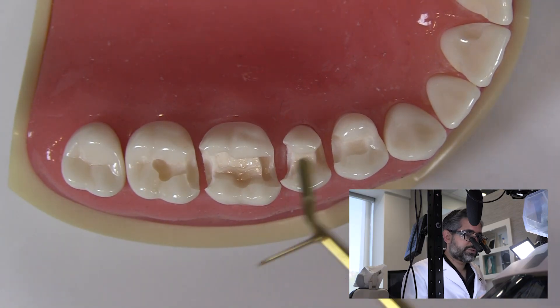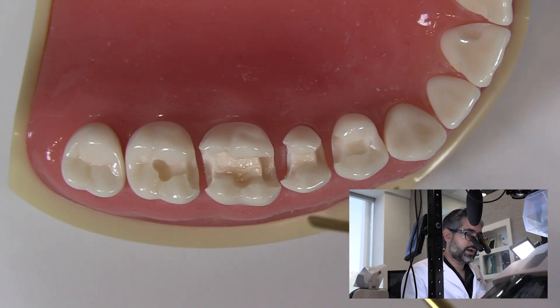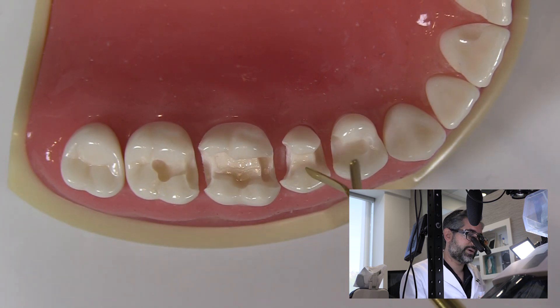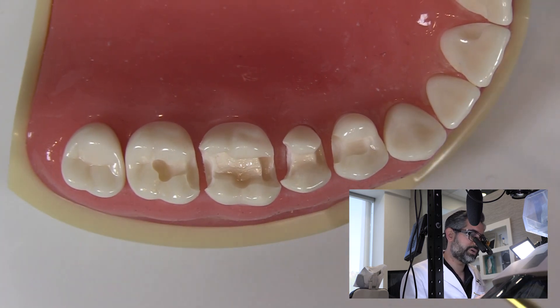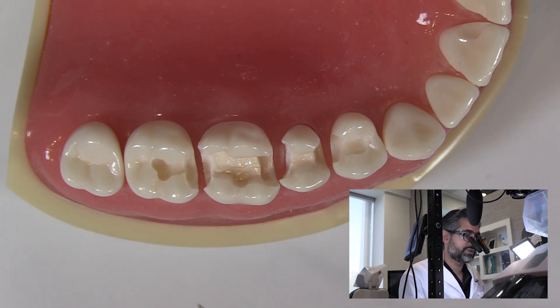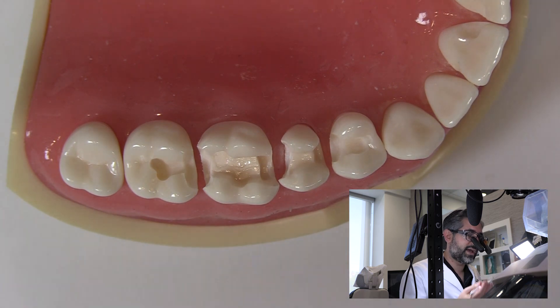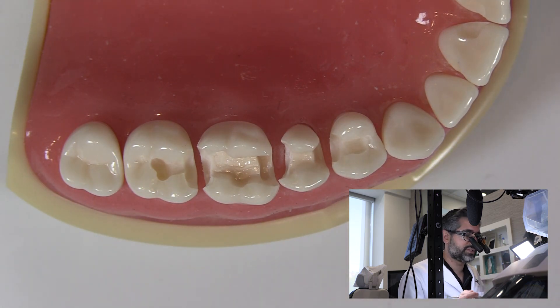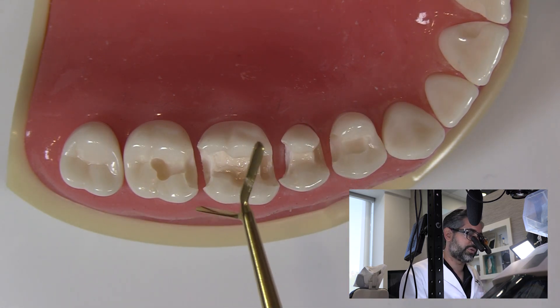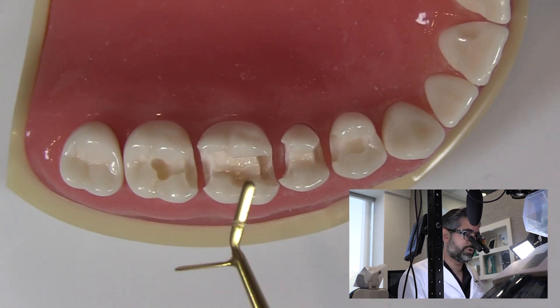When looking at a case with three teeth requiring direct restorations, this is going to take a fair amount of time. The way I think about it is to restore the most distal tooth first, because as the patient gets tired with rubber dam and isolation on, I usually have to fight them to keep open, and a bite block becomes uncomfortable a couple hours into the appointment.